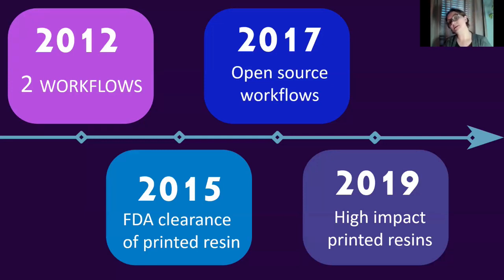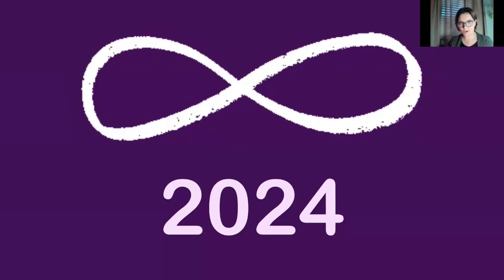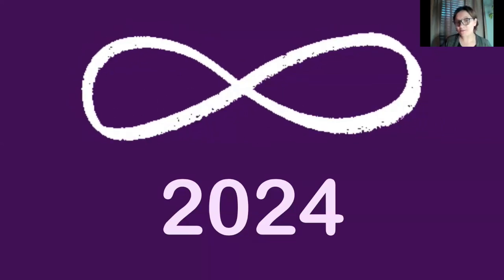And then we really started to see things open up at the very end of 2019, right before the pandemic, when we had high impact printed resins that were starting to have improved physical properties. So now we have the software, we have the hardware, we have the workflows, we have the materials, we have the labs, we have the scanners. And so today in 2024, there are unlimited workflows, unlimited options you can make digital dentures.